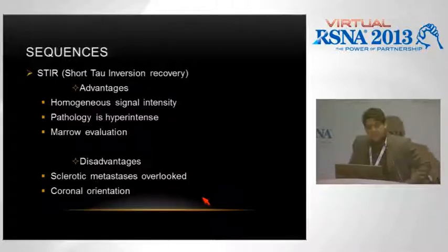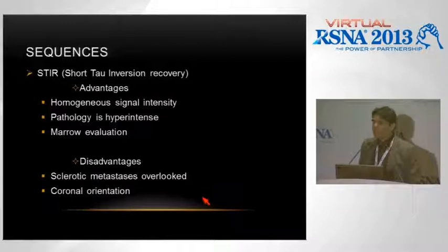One of my colleagues did ask which sequences we use for whole body imaging. And I will tell you this, that there is no clear consensus as to which sequences go on to make up your protocol. And in talking to my colleagues from other institutions, everybody has their own way of doing this, which hopefully in the near future will be more standardized.